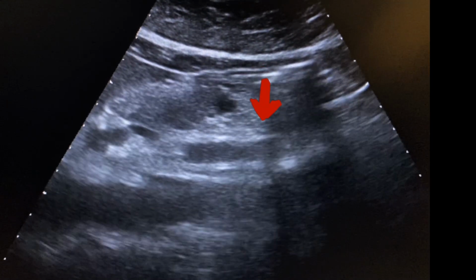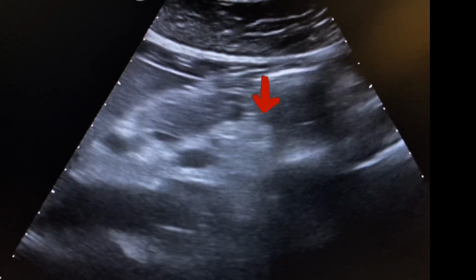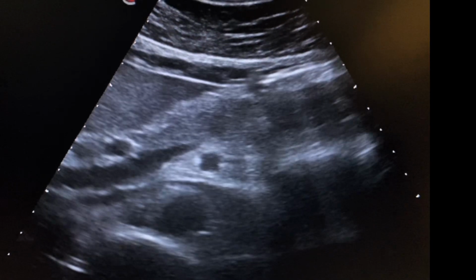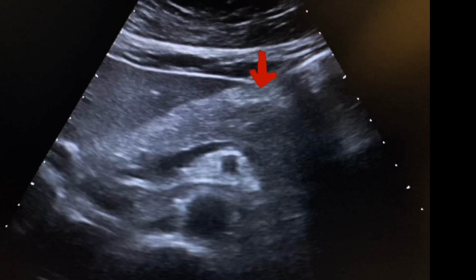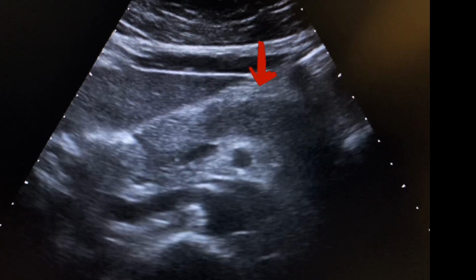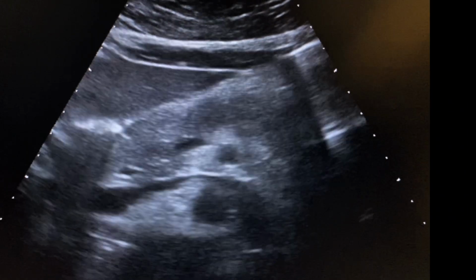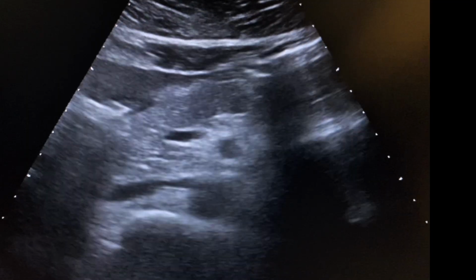If we see the peripancreatic area of tail, which is echogenic, as more inflammation is here, the size of pancreas appears to be normal, which is approximately between 2 to 2.5 centimeter from uncinate process to the tail of the body.